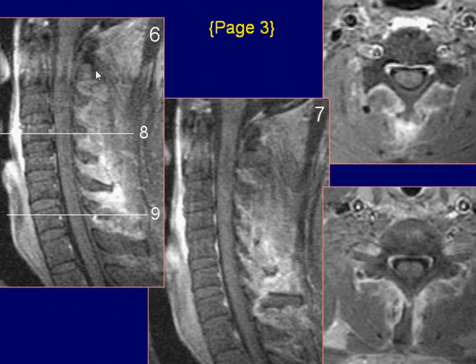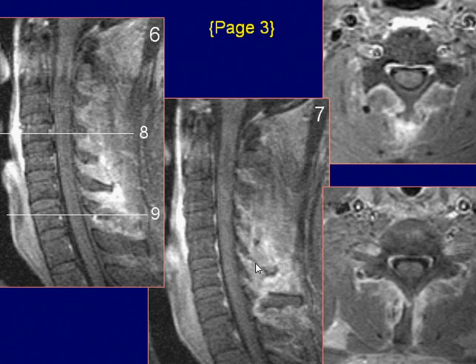Sagittal post-gadolinium fat saturation T1-weighted image demonstrates intense enhancement in the region of the interspinous ligament and pre-vertebral space. There is bony discontinuity and displacement of the C7 spinous process as seen on this image.